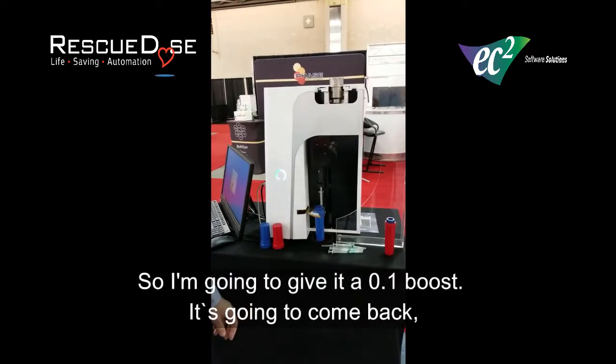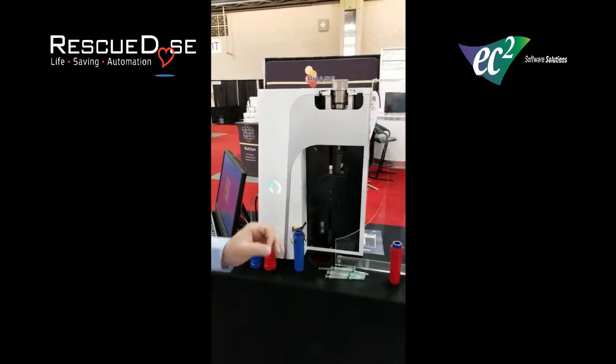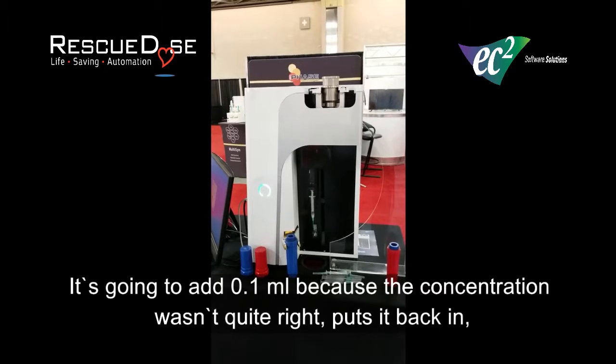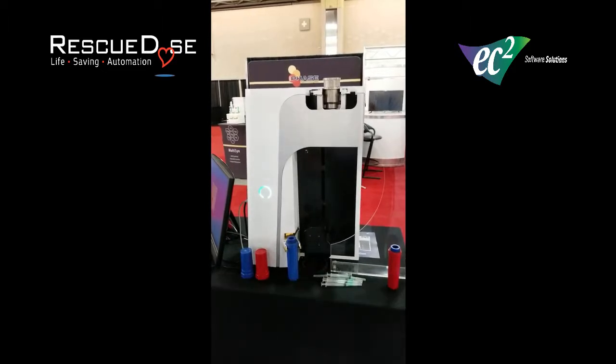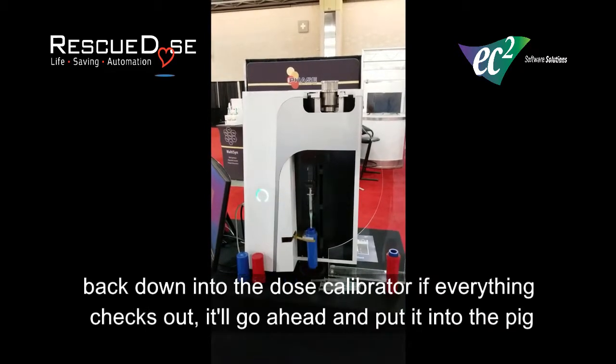It's going to come back, decap it again, spin up and around. It's going to add 0.1 mil because the concentration wasn't quite right. Puts it back in, puts it back down to the dose calibrator. If everything checks out, I'm going to go ahead and put it into the pig.